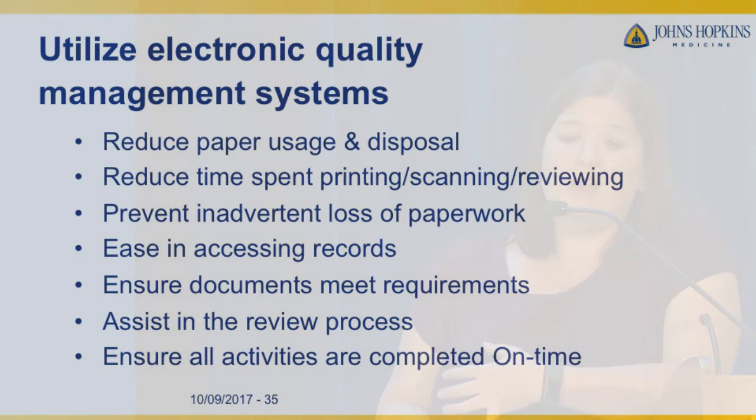We need to prevent inadvertent loss of paperwork. So how many times has someone come in and said, I want to see the competency for this person, and you're going through a drawer because you have to keep 5 years' worth, right? And you're going through a drawer trying to find that one person for that 1 year's competency assessment, and you have trouble finding it. When I scan it, it's much easier to find for me. So if we can have a way that we don't even have to deal with that, you don't have to worry about losing it. Being able to access those records a little bit easier.